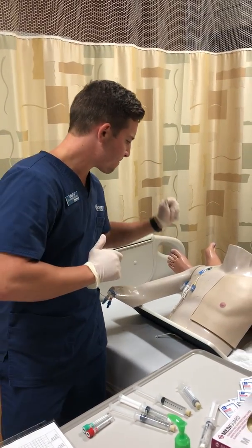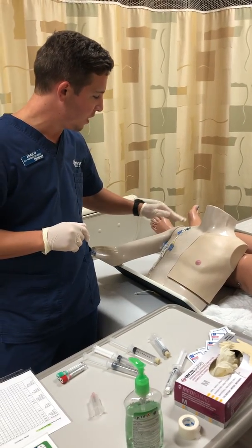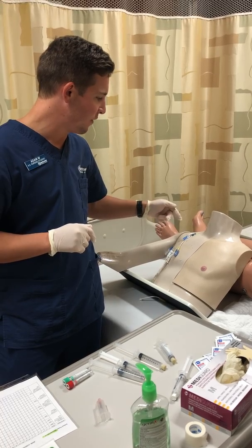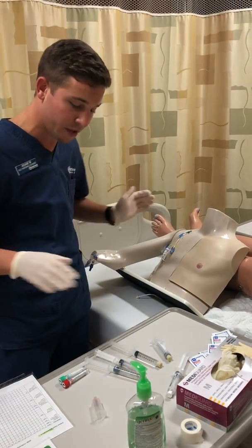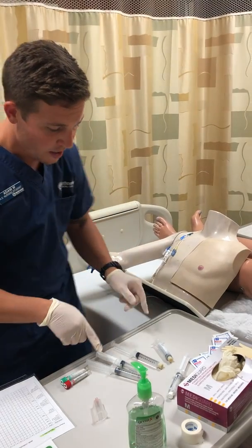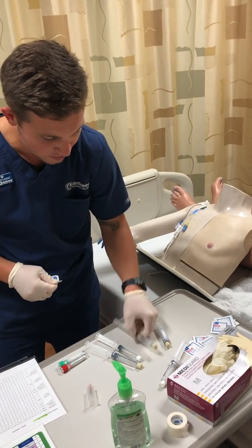Alright, so here we're also going to look at our site before we pull anything out and look for any redness or any sort of infection, any sort of infiltration, any swelling and stuff. Everything looks really good here. So here I have everything that I need here. So first things first, we're going to flush.